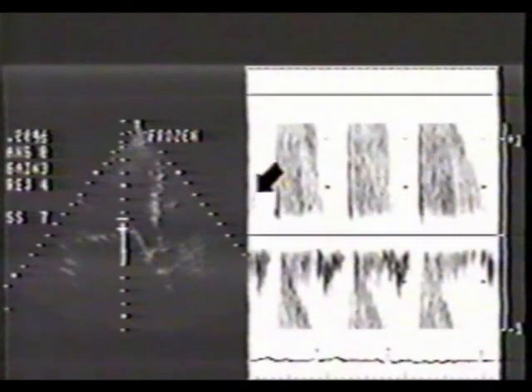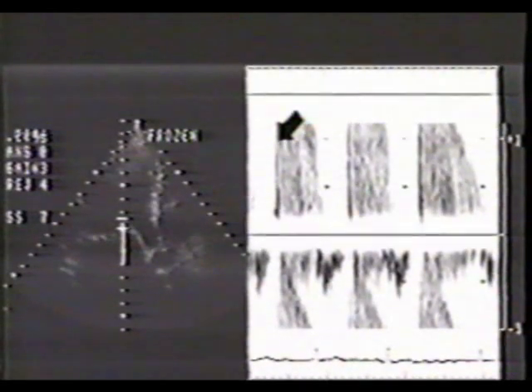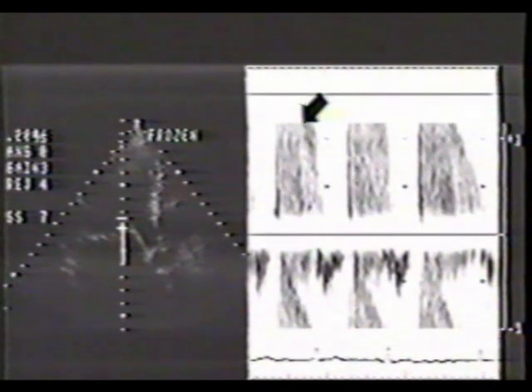In diastole, the jet of mitral stenosis will be directed toward the transducer, which is at the apex. The diastolic velocity spectrum is therefore initially recorded above the baseline. However, the velocity of the jet has exceeded the transducer's Nyquist limit, and aliasing has occurred. The top portion of the velocity spectrum has been chopped off and wrapped around and appears below the baseline. We therefore cannot determine an accurate maximum velocity, and this prevents us from calculating an accurate pressure gradient.